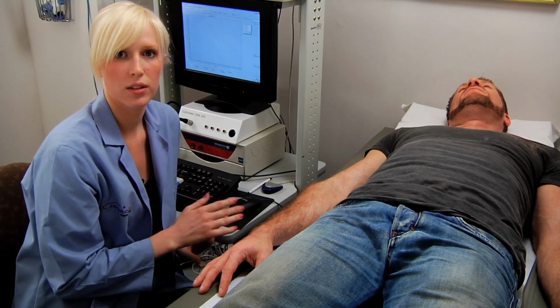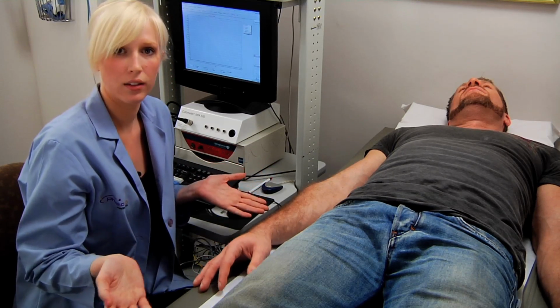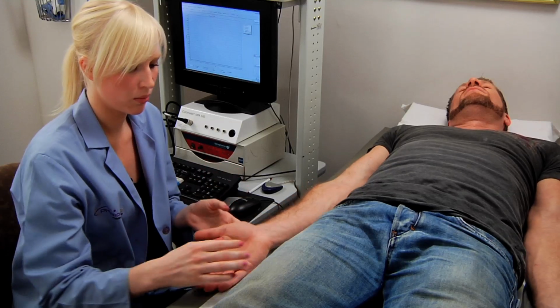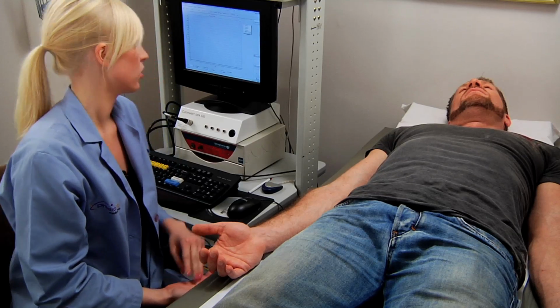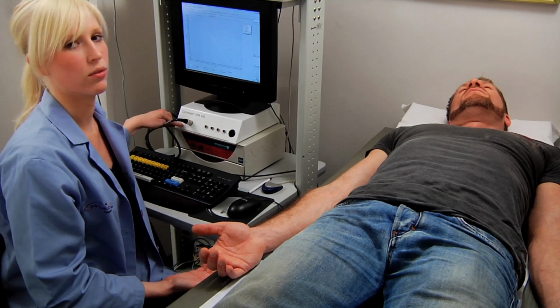First, I want you to notice that my patient is lying flat. I'm going to ask him to put his palm facing the ceiling, and his forearm will be flat. But before you get started with this test, you want to make sure you have a pen, a measuring tape, and you want to make sure the green light is on for the cutometer.